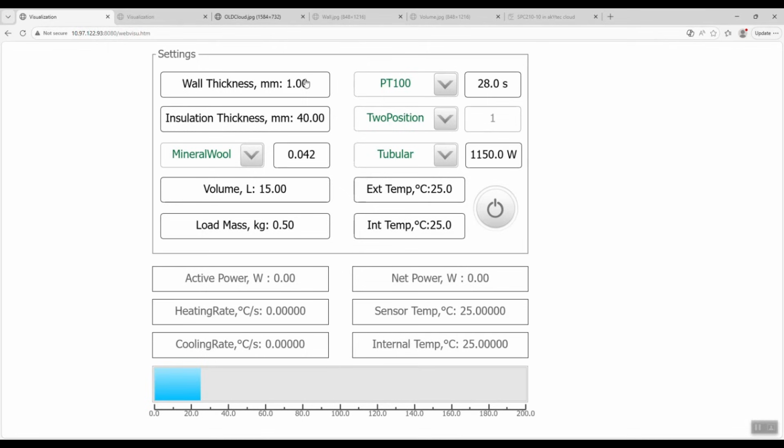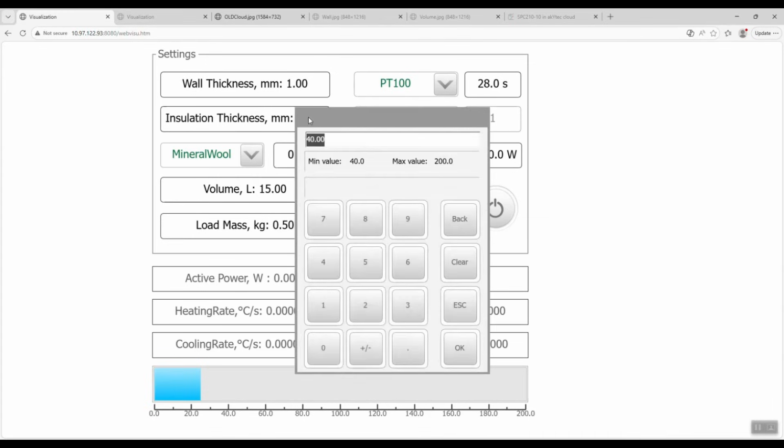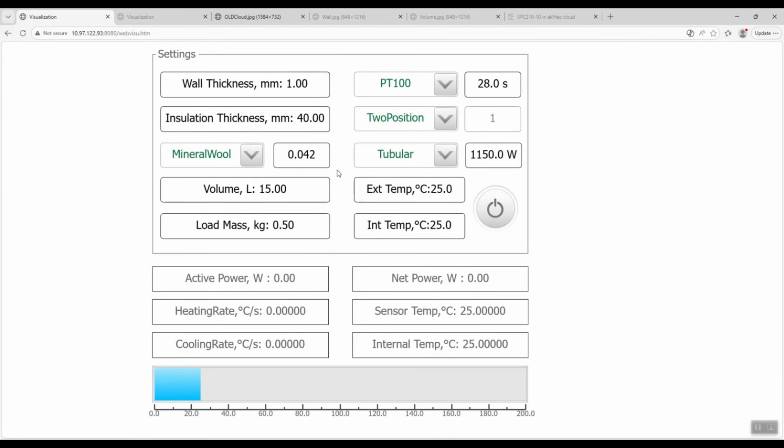The first parameter is the thickness of the sterilizer's metal walls, which we can adjust from 1 to 4 millimeters. The second parameter is the thickness of the sterilizer's insulation, which we can adjust from 40 to 200 millimeters. The third parameter is the type of insulation material.